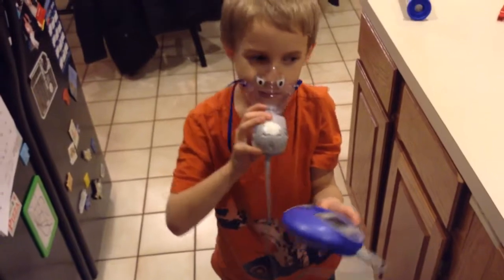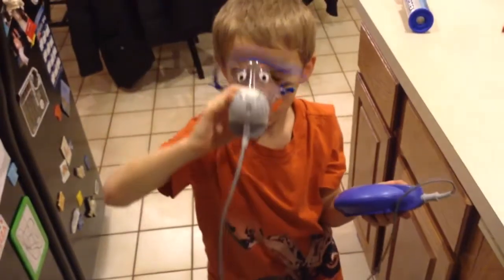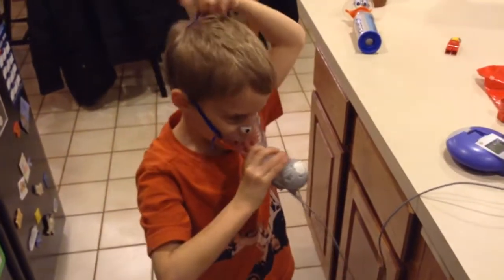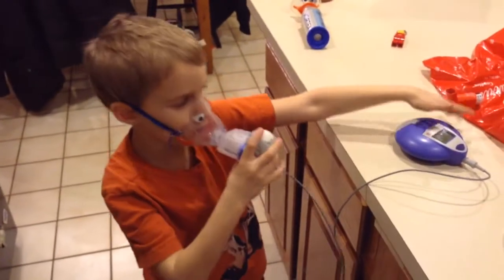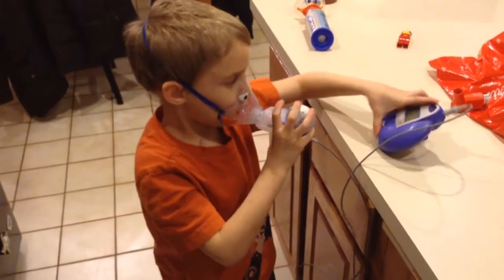And put it on like this. Okay, I'm going to put this on. Let your parents wash this and build this. Simple.